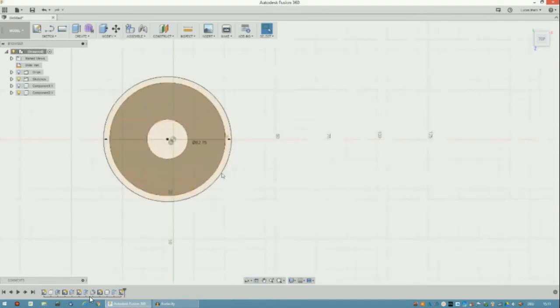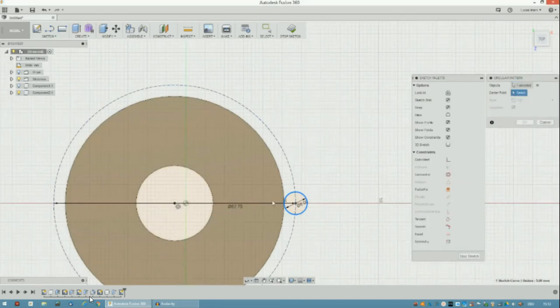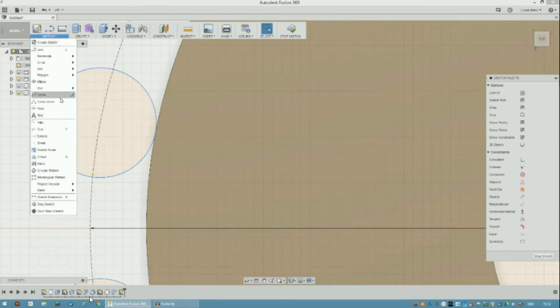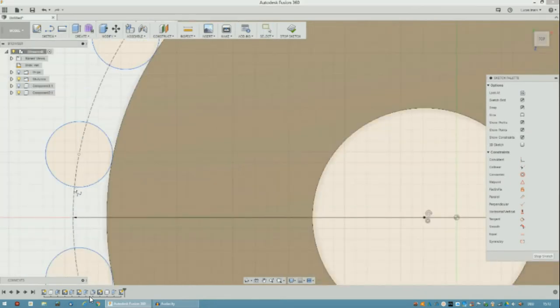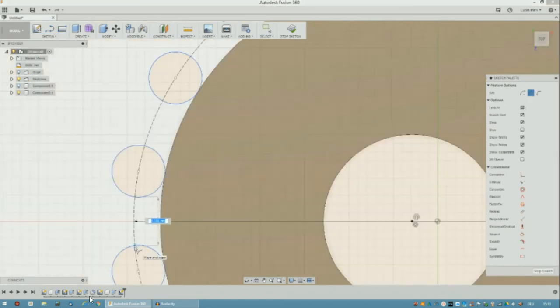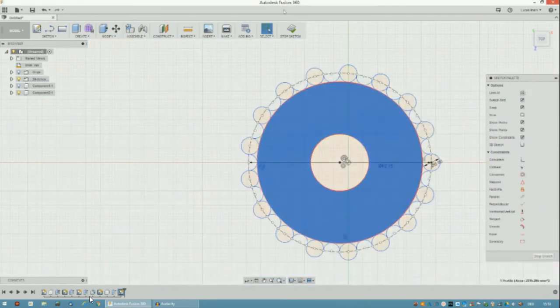And yeah, I was trying around a few things, and now we are drawing the teeth. Actually, we made 17 of these simply by patterning in a circular pattern, and now it's time to choose them all. I first tried to draw a spline and other stuff, but I ended up doing a half circle because it's the easiest way to get it to fit perfectly. It was actually the second time trying to design a hypercycloidal reduction. That's also why I found out the 2.675 at the beginning, the offset.